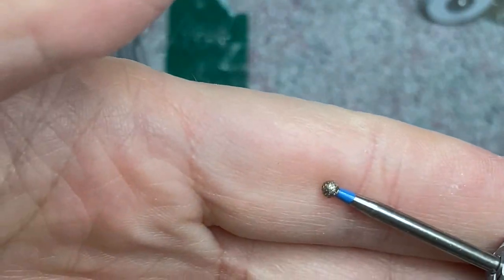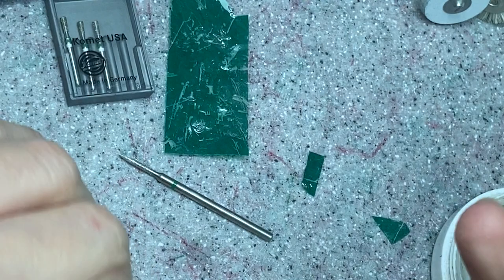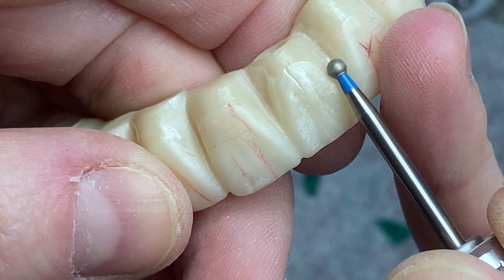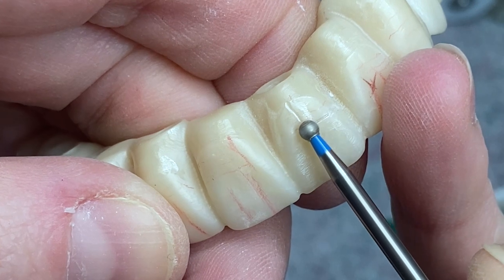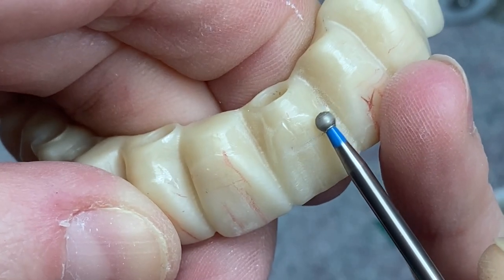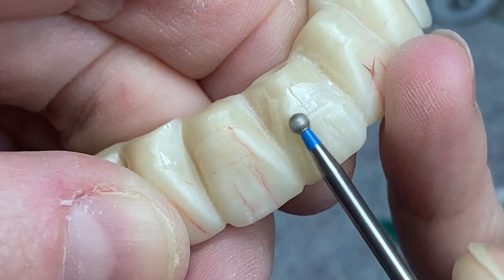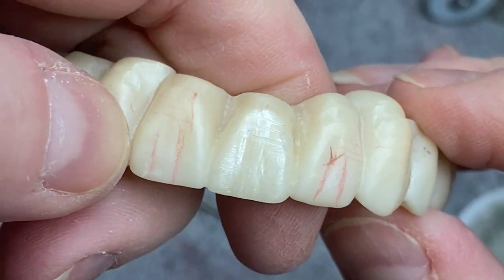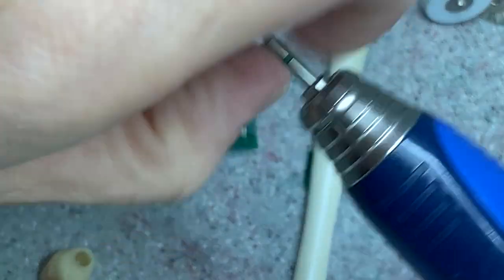Then I'm gonna take this burr — I don't know what it's called, but here's the number. You can make a couple of parallel lines with it too.